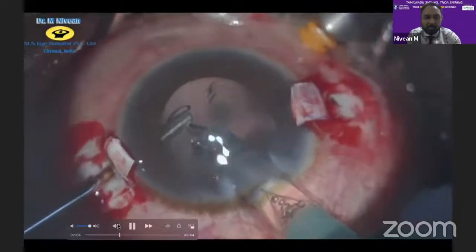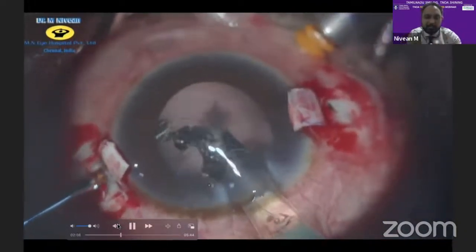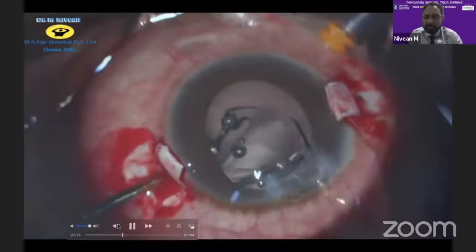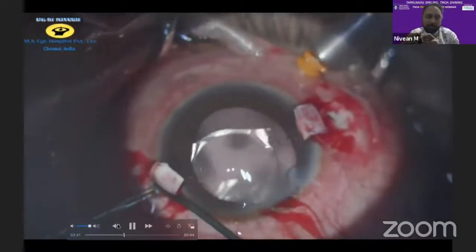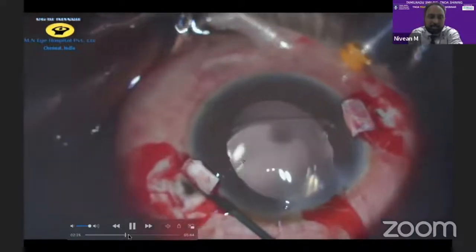But at this time, we do not pull out the lens, so the rest of the lens is injected, because pulling can actually detach it from the body of the lens. So now the rest of the lens is injected and the trailing haptic is kept in the wound, or sometimes you can keep it over the iris and then gently pull it out. You can hear a pop sound, and when it happens, the T opens up. So that is almost the end of one side, isn't it?